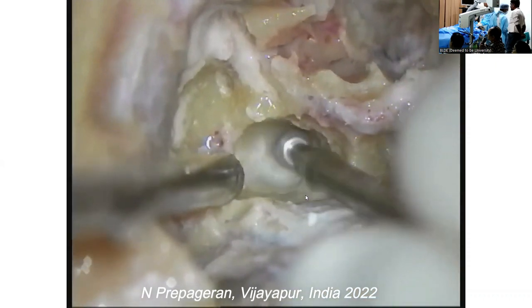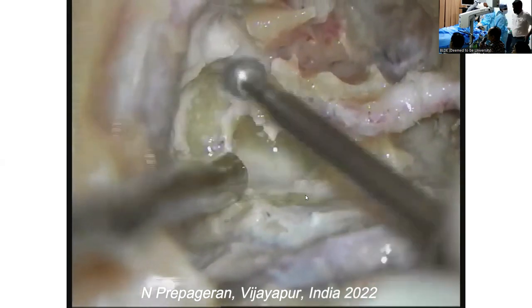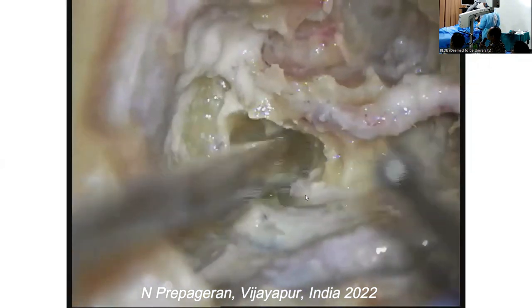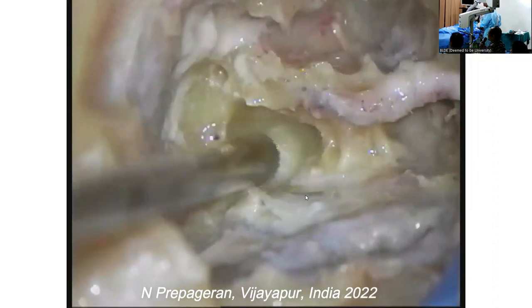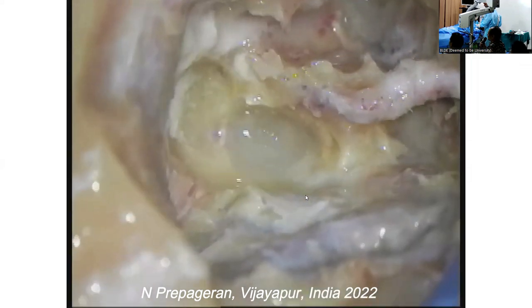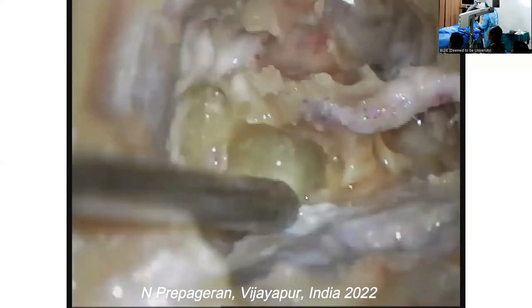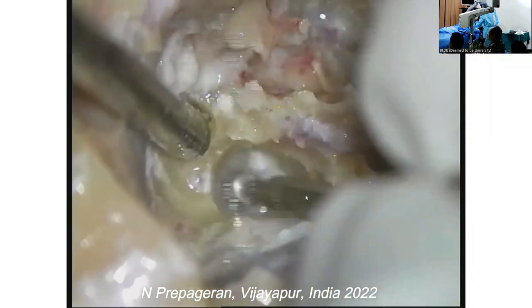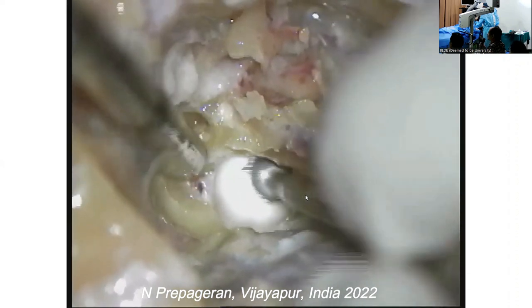Okay, can you see that? I am coming to view here. The kick. You saw the kick? Did you all see the kick just now? Yes. Okay, that's the IAM, guys. Can you see? Well, now the jugular bulb is bleeding. So drill at the same level as the IAM.